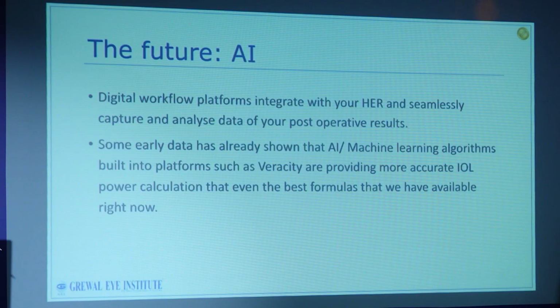And we're hearing a lot about AI, and ChatGPT has really come into the commonplace. So everybody's talking about it. We do have formulas that have been available now for a few years, which are based on machine learning. But at the AACRS this time, there was actually some data presented which showed that the new formulas, which are incorporated into the new cataract workflow solution, which is Veracity by Zeiss, are actually more accurate than any other formula that is available right now. That is the advantage of something which captures data end to end. It is capturing data seamlessly, it is able to utilize that data, so it's not dependent on you uploading that data.